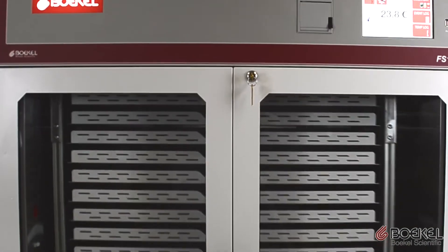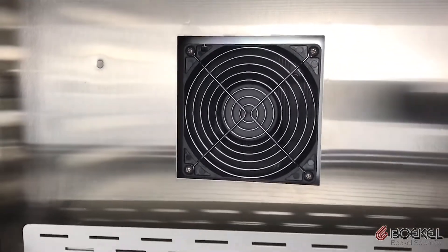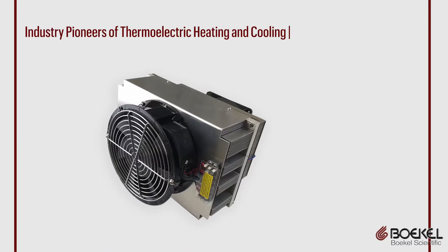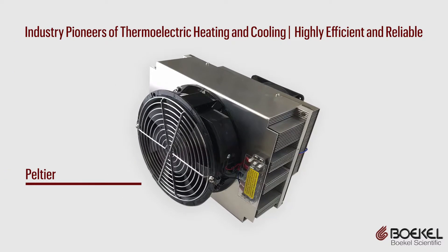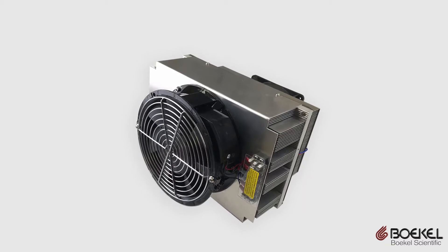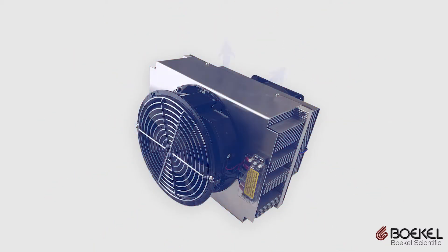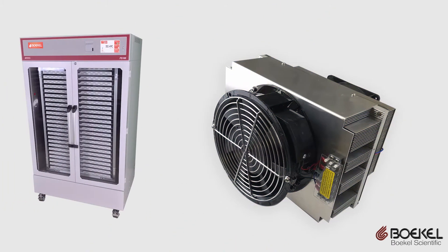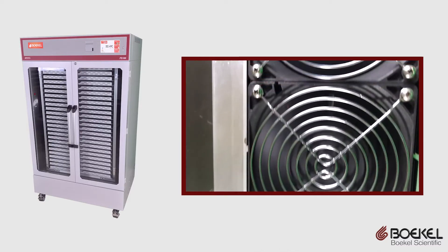Bocal Scientific pioneered the use of thermoelectric devices known as Peltiers in platelet incubators — they were the first company to implement this exciting new technology. Peltiers are high-efficiency solid-state devices that can heat and cool. Bocal Scientific has now applied this technology in a large floor-standing unit to eliminate the potential failures associated with conventional gas refrigerant loops and compressors.